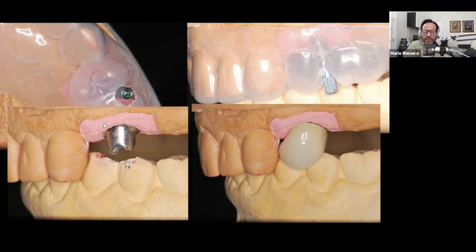Yes, Mario. And one of the things I want to mention here is that even though we're talking about non-ideal implants, when I look at this photo, it really makes more sense to me the importance of planning. Even if you're a general dentist, even if you're just going to restore a single implant, it's important to take the time for good planning so that things like this can be avoided. Yes, they can be fixed, they can be corrected, but they're never going to be ideal. You have to expect long-term biomechanical issues with implants like this because of the lack of planning.